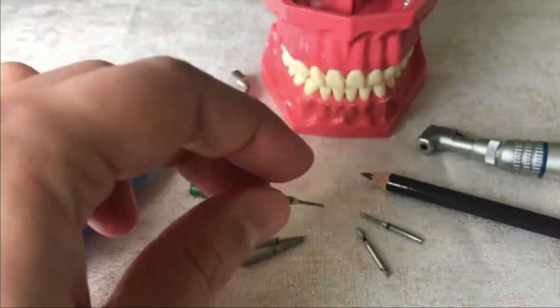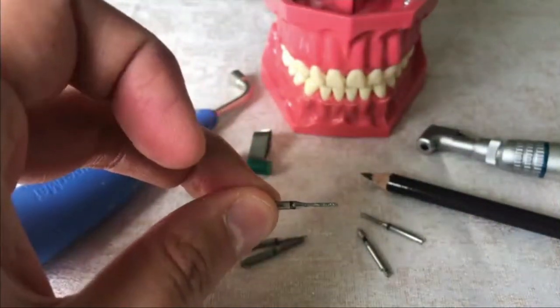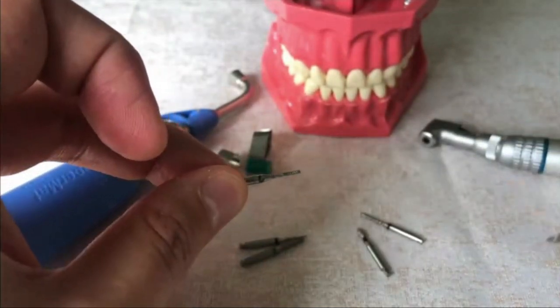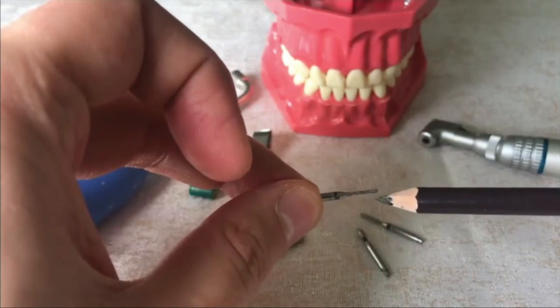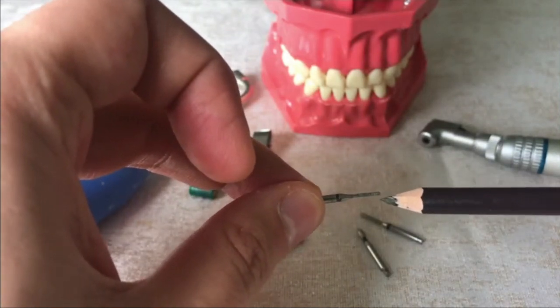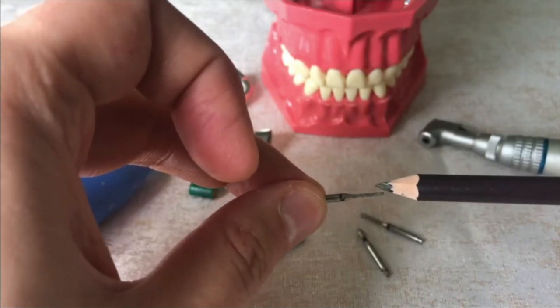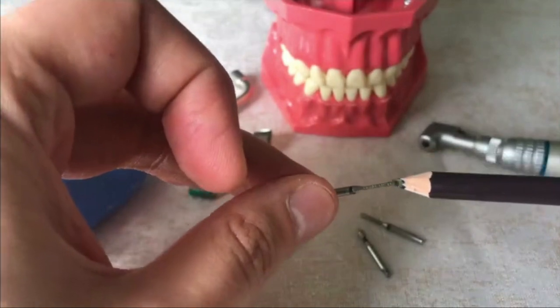The second one is the shoulder burr. The burrs we use determine the shape of the bevel of the restoration we will make. Today I will use shoulder type burrs at 2 different thicknesses. The tip of this burr is 90 degree angled. If you mistakenly choose a chamfer type burr, you will change the bevel type of your preparation. Bevel also means finishing line.